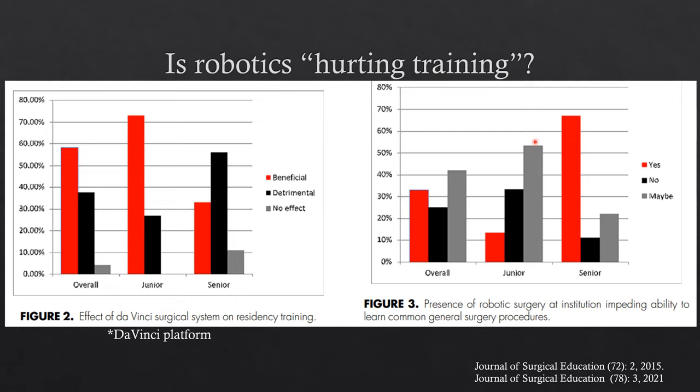So that's where the power is. It's the predictive software. That's where I see it getting better. Because right now, if you think about it, what's really the benefit over just navigation? I just don't see it. It's great, but you can do all the same things with navigation. If anything, maybe you have a little less freedom, because the robot fixes you in a trajectory and you can't really undo it. And if it gets inaccurate at a certain point during the case, it's such a pain.